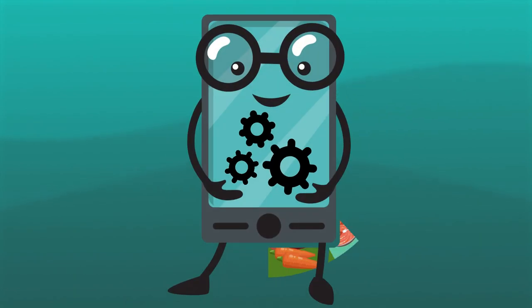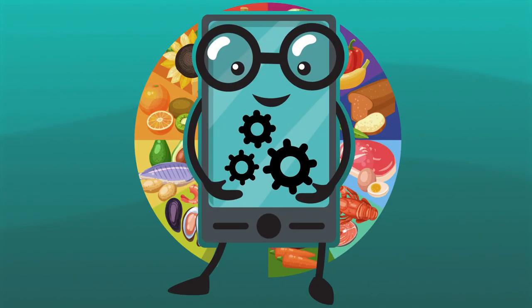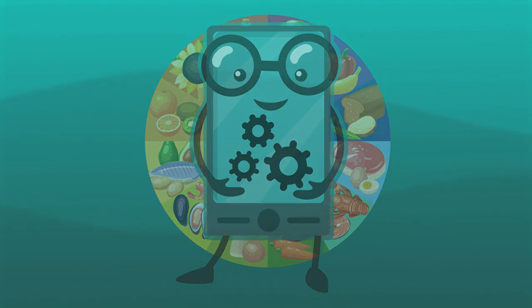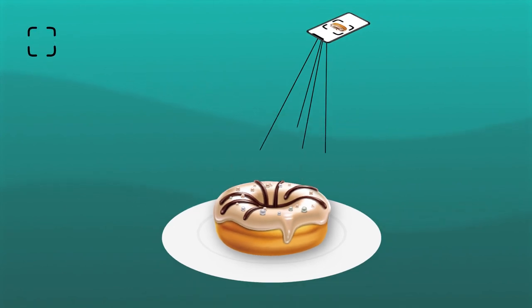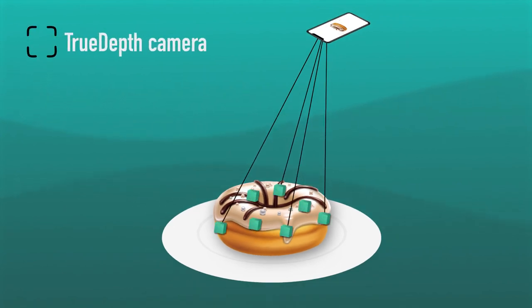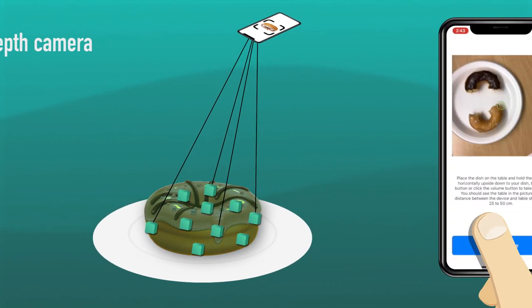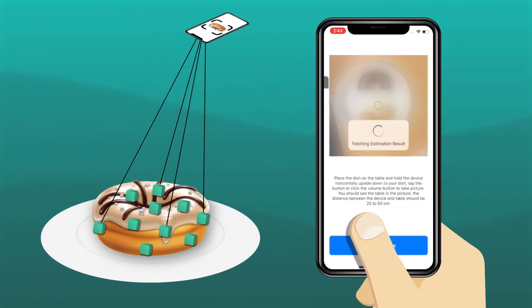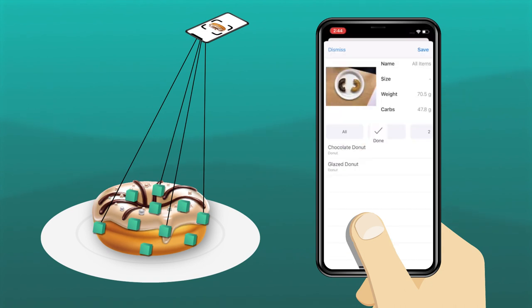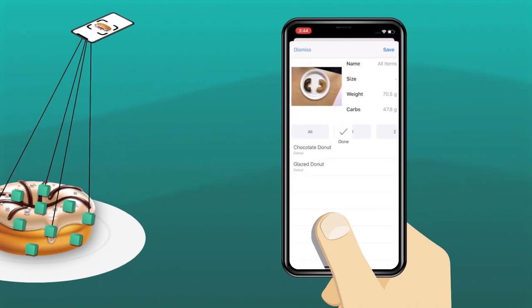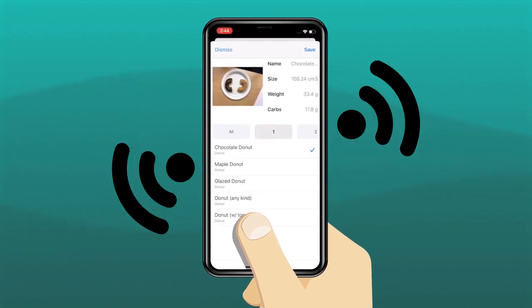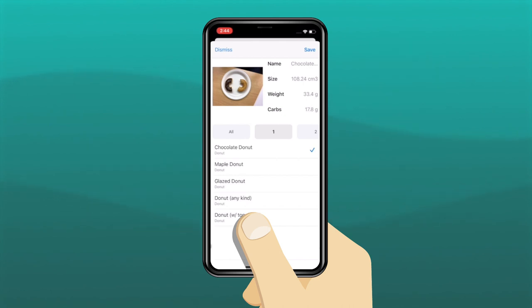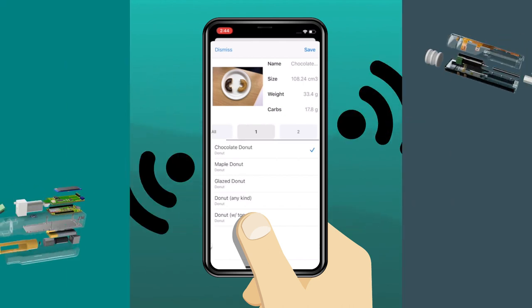To estimate food carbohydrate content, we developed a smartphone app that utilizes the TrueDepth camera together with deep learning to reconstruct nutrient information. The user takes a picture of their meal, and the carbohydrate information is then calculated and directly transmitted to the all-in-one pen to inform the insulin dosing.